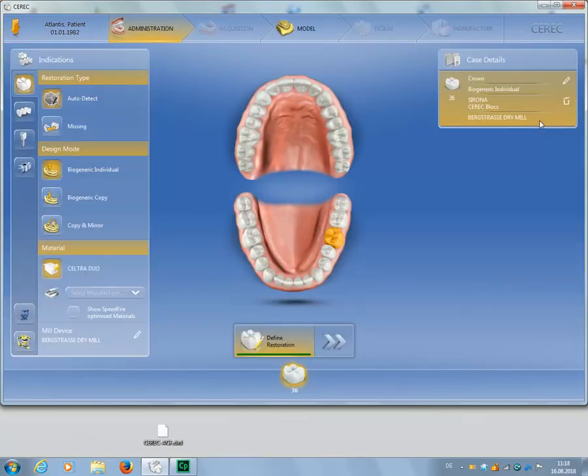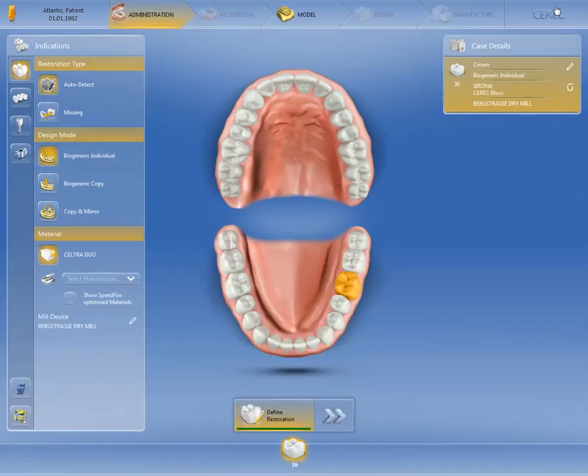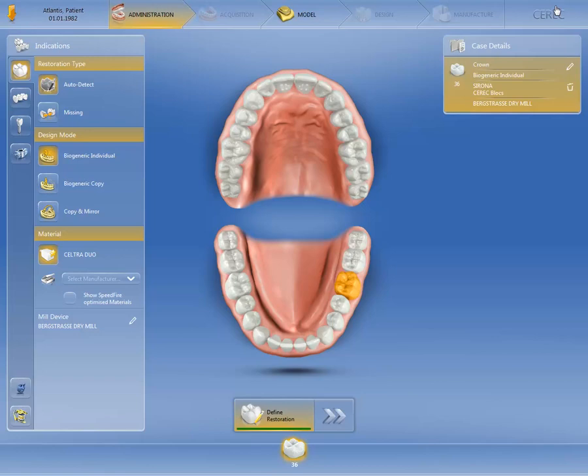We expand the software to full view, and start the subsequent processing of the data. Since the model data are transmitted with the Atlantis Core File, we skip the acquisition phase, and proceed with the model phase.